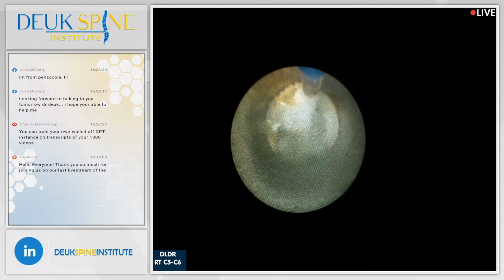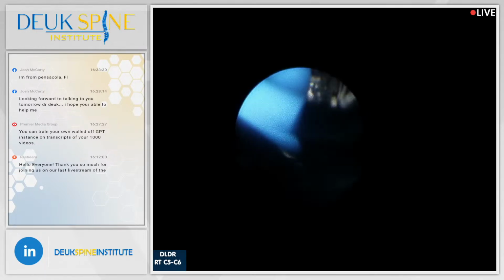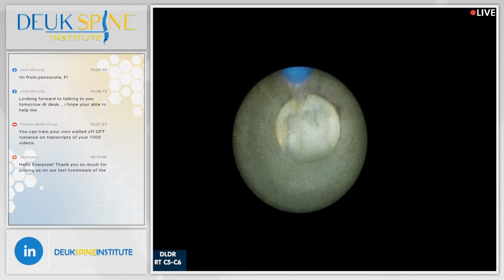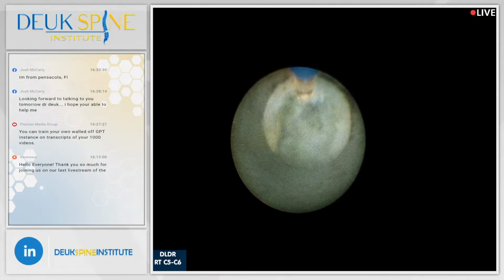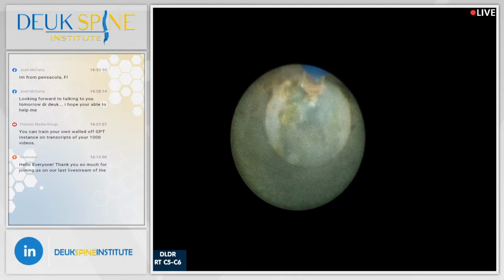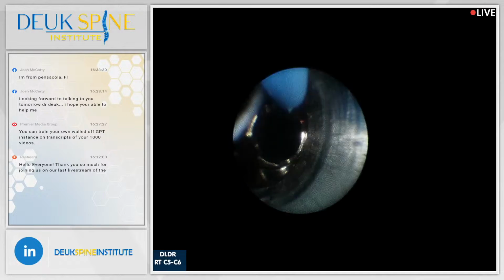They use the what? The YAG laser in plastic surgery. Oh, plastic surgery. Yep. What do they do with it? Laser hair removal. Resurfacing too. Really? For acne scars. Oh, good. Yep. Well, it's very popular. It's a very safe laser. That's why we use it. It's safe and effective. All right, that should be it.